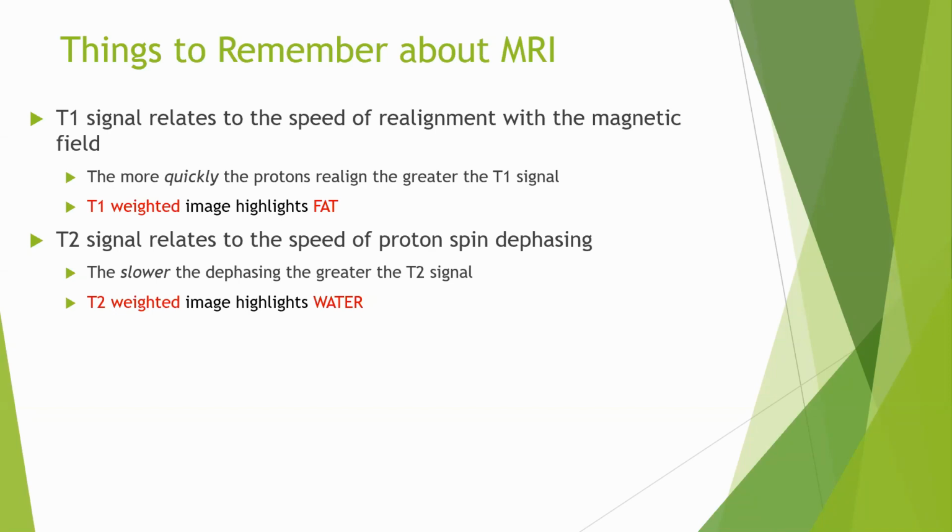But if you are a neuro specialist, there could be a whole different type of weighted signals that you have to learn, and I do that in advanced studies of MRI, but obviously not in the basics, because you need the understanding of the foundation to understand those special techniques.